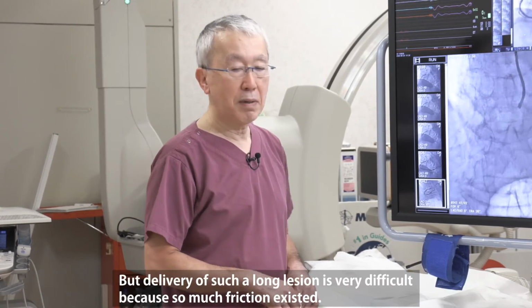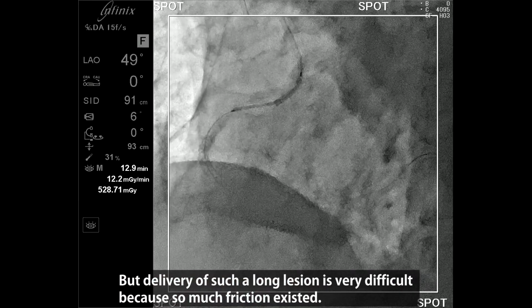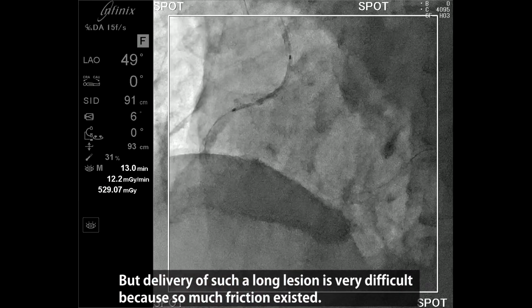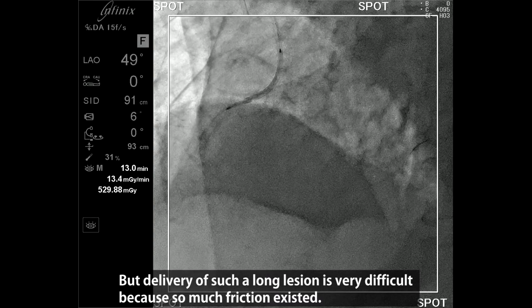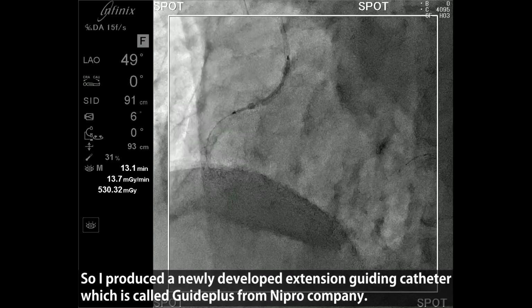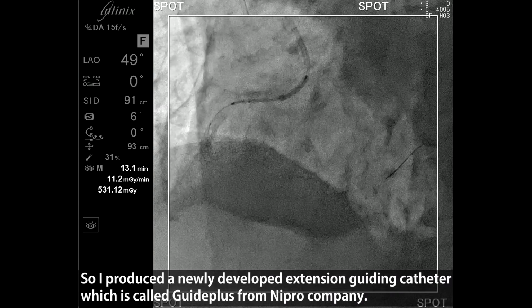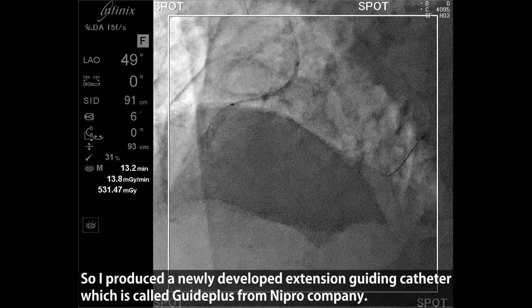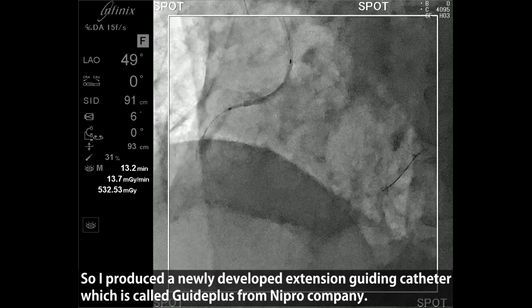But delivery in such a long lesion is very difficult because of so much friction. So I used a newly developed extension guiding catheter, called Guide Plus from Nipro company.